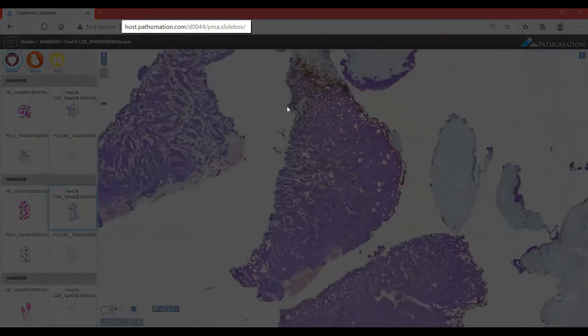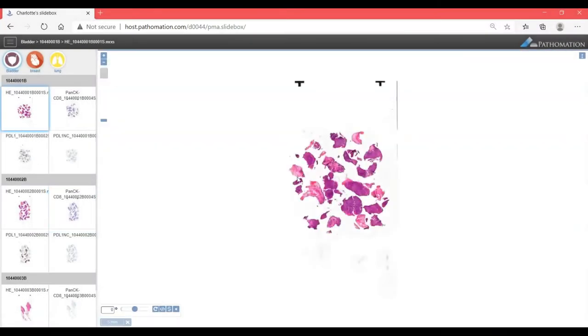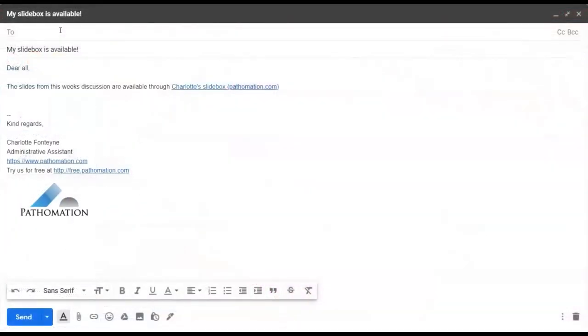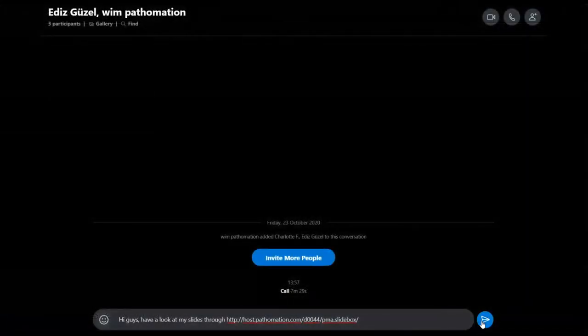The URL is the only piece of information that you need to share your collection with people. End users don't need a username or password. You can distribute and use the URL freely, be it through email or instant messaging. You can also refer to it from other websites with a simple hyperlink.